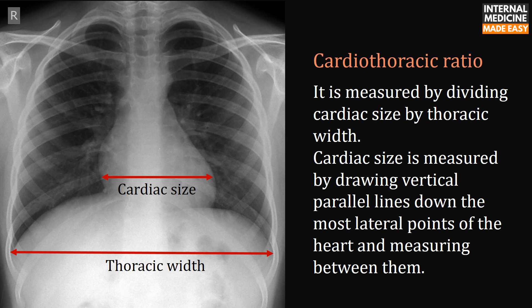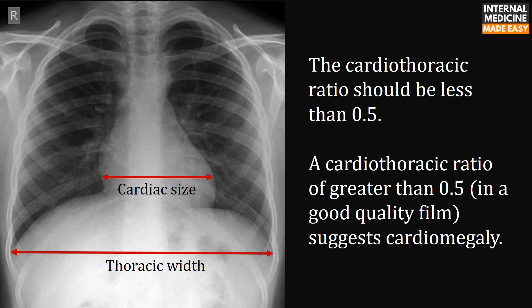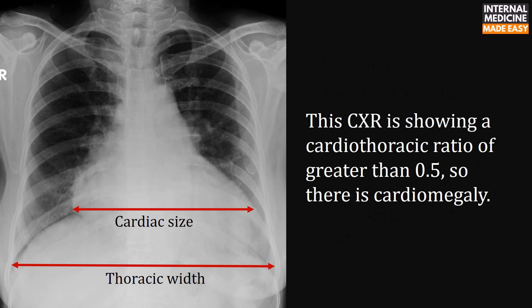The cardiothoracic ratio is measured by dividing cardiac size by thoracic width. Cardiac size is measured by drawing vertical parallel lines down the most lateral points of the heart and measuring between them. The thoracic width is measured by drawing vertical parallel lines down the inner aspect of the widest points of the ribcage. The cardiothoracic ratio should be less than 0.5 — a ratio greater than 0.5 on a good quality film suggests cardiomegaly. This chest x-ray is showing a cardiothoracic ratio greater than 0.5, indicating cardiomegaly.